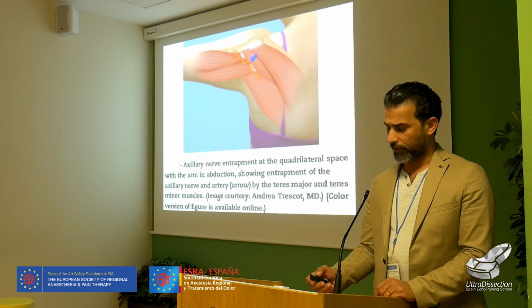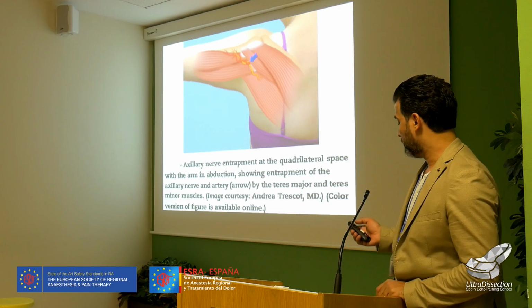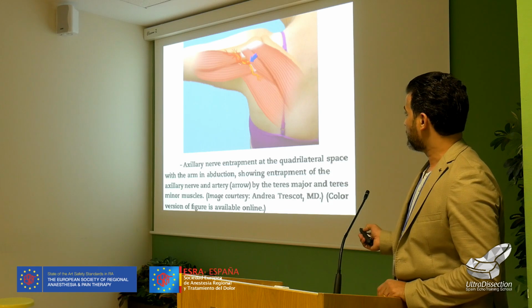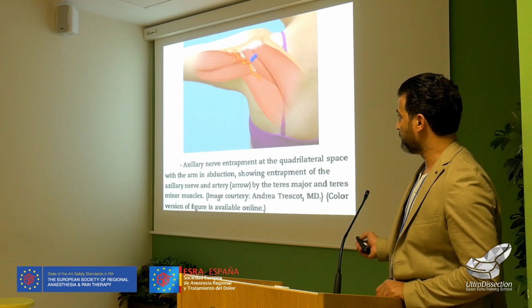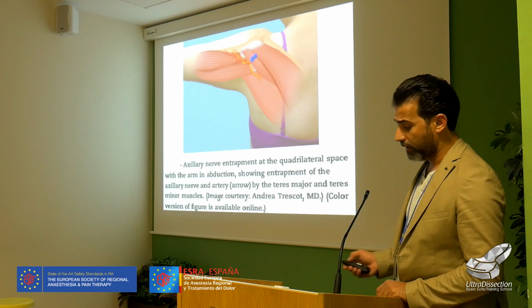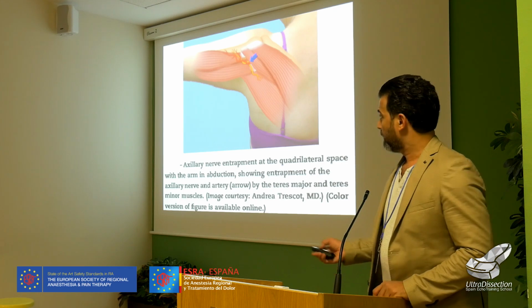So this is one example. You can see here the axillary nerve and the axillary artery entrapped between the teres major and teres minor muscles, causing the pain.